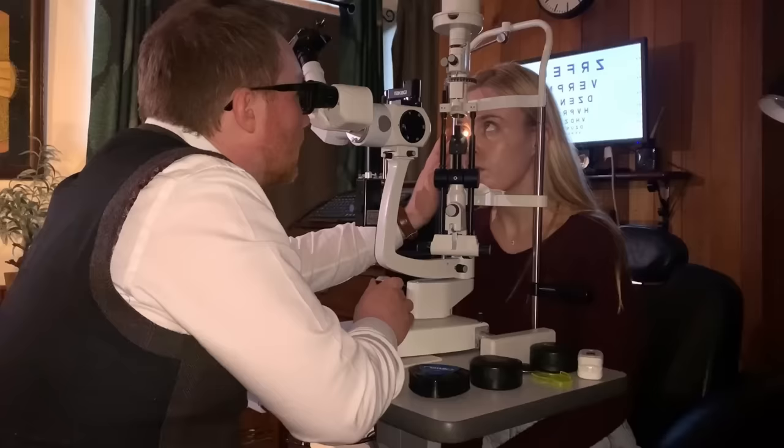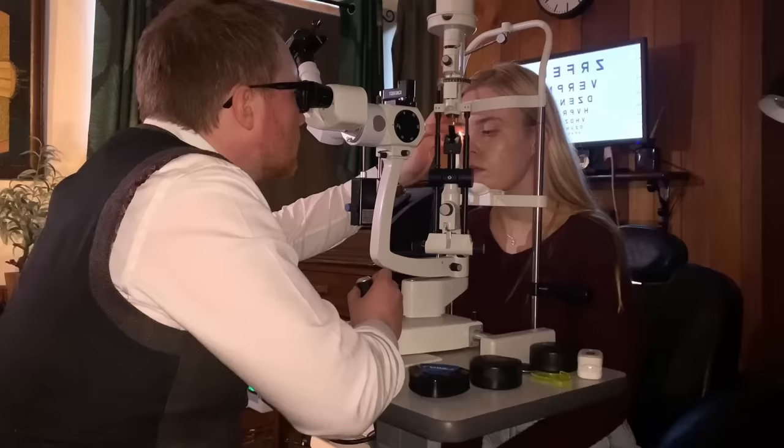And looking over to your left. And looking over to your right. Looking up, very gently over your eyelid. And looking down. Good. And then looking past my ear for me, that's good.